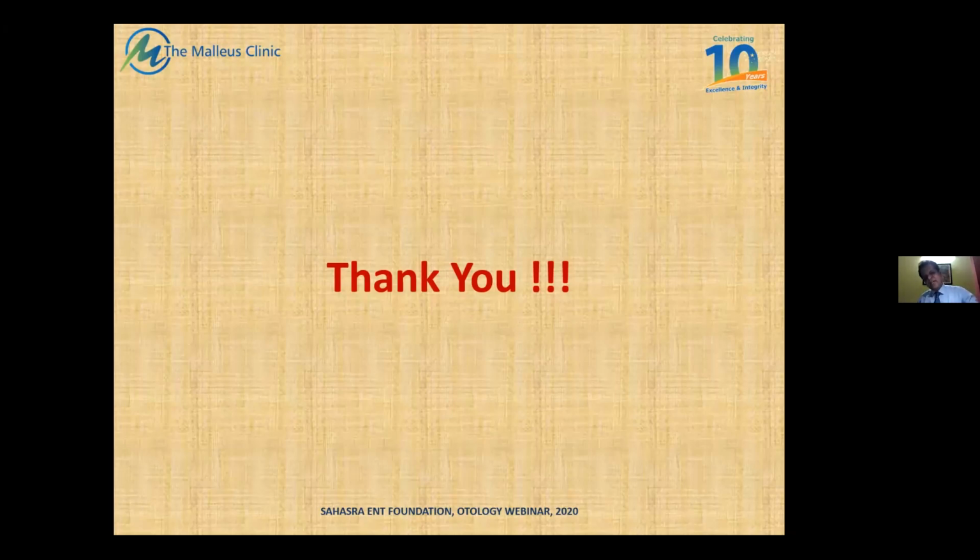But end of the day, if I am an examiner, I'm sure this confusion is more for our junior, younger friends than for the senior consultants. If the student tells me one before the other, I'm sure I'll give the student that much of leeway. Fine, the student knows that there is something called a snake eye appearance. For me, it's always been the two segments of the facial nerve. But yes, you can consider in the actual scans the two lumens of the superior semicircular canal as the snake eye appearance as well.